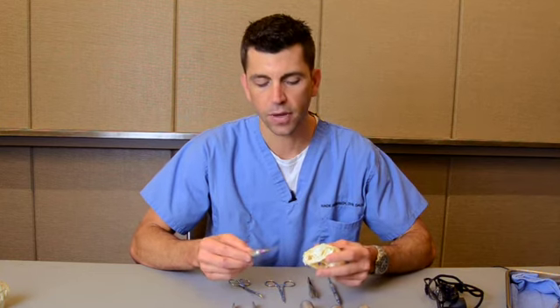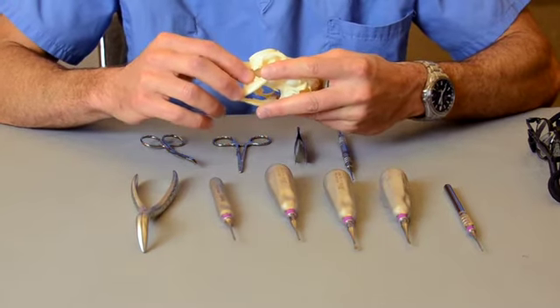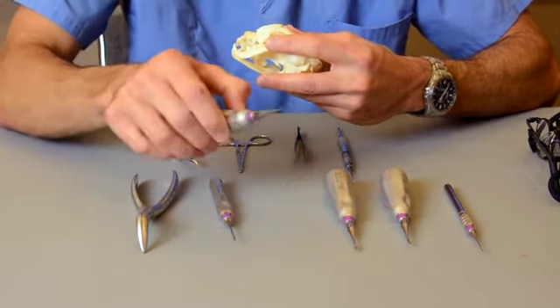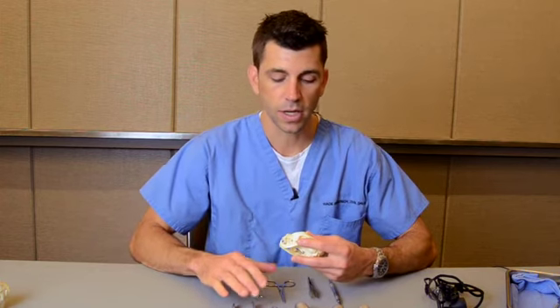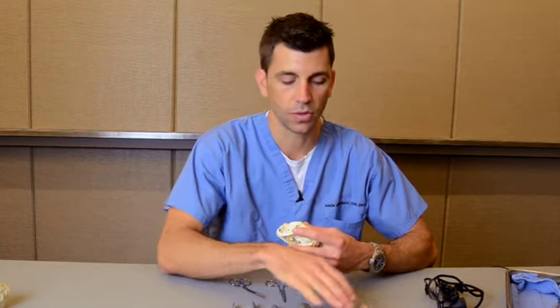And this elevator I use for about 75% to 80% of the feline extractions that I perform. Only in a few teeth, such as the canines, the mandibular molar mesial root, and the maxillary fourth premolar distal root, would you need a larger size elevator, such as your typical winged elevator in a size 2 or 3. So for all the dental extractions we perform in cats, we only need the very small feline dental elevator, as well as possibly your typical winged sizes 1, 2, and 3.